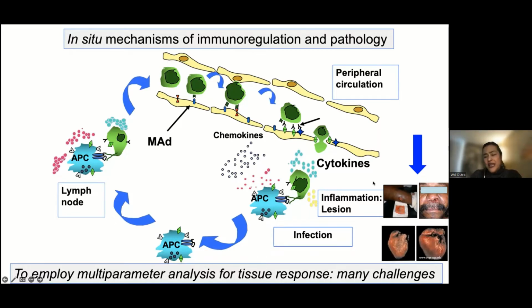So to understand what happens in the place where the disease actually manifests itself, the way to do it is to take lesions from the skin, from the mucosal site in the case of leishmaniasis, or parts of the heart of the patients with Chagas disease, and try to stain and characterize the cells that are mediating the tissue destruction, that compose the inflammatory infiltrate.